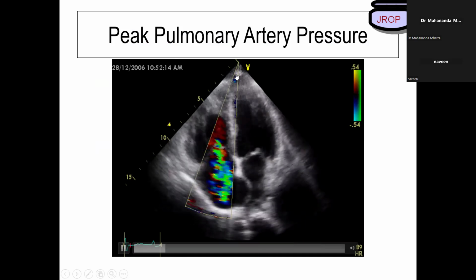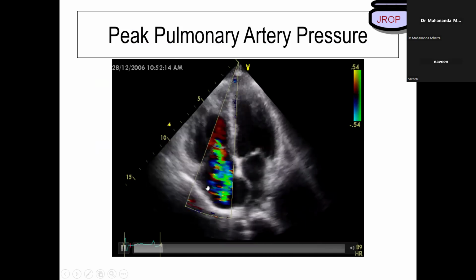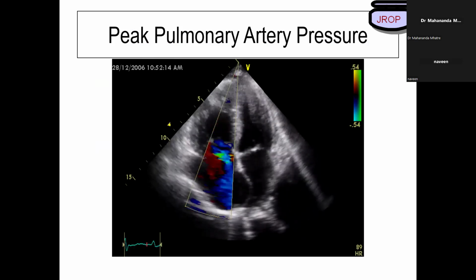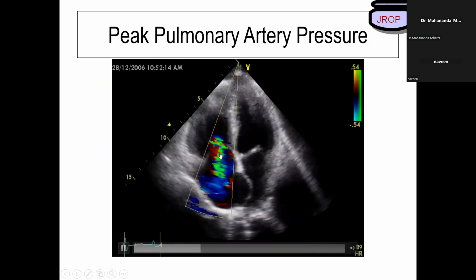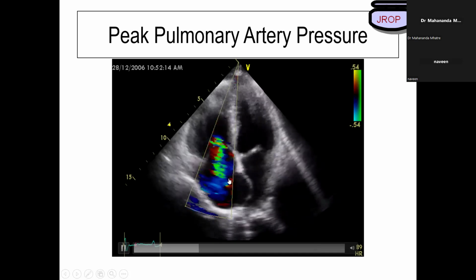In the 4-chamber view, your cursor is along with this line, so you are not able to see this Doppler spectrum pattern. Correct? That is the one reason why you're not able to see the TR jet gradients properly. Which is the window among the 5 of them where you can get this best? You can align your beam according to the interatrial septum.